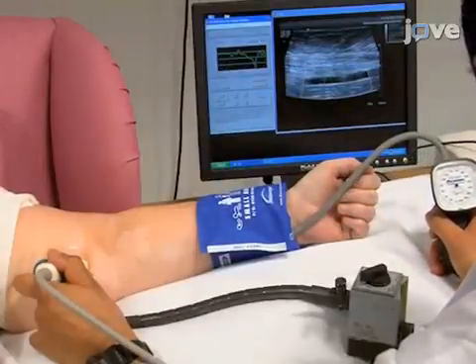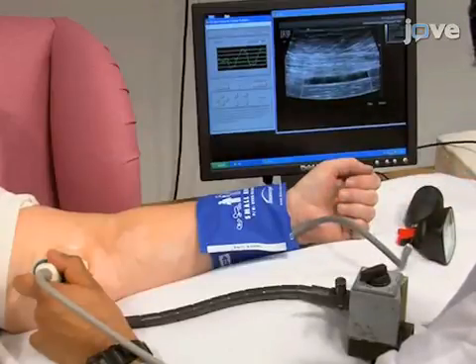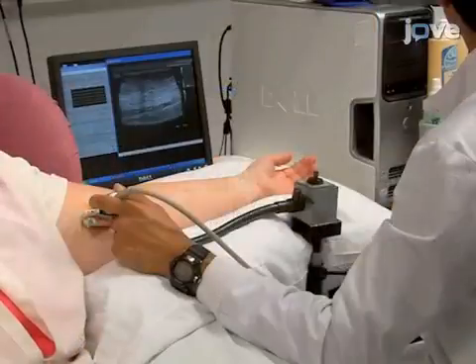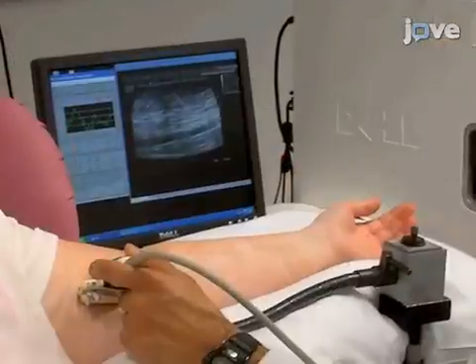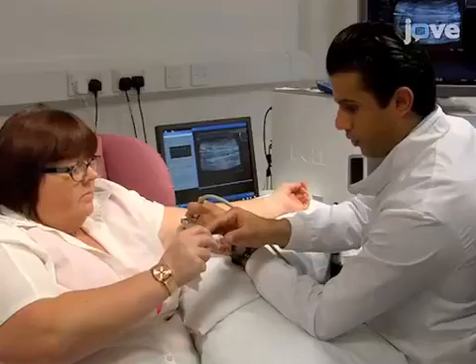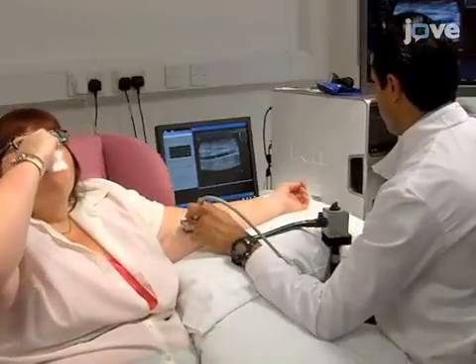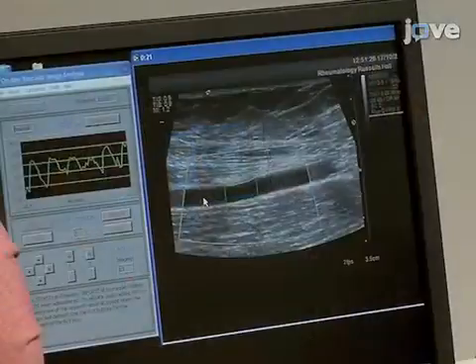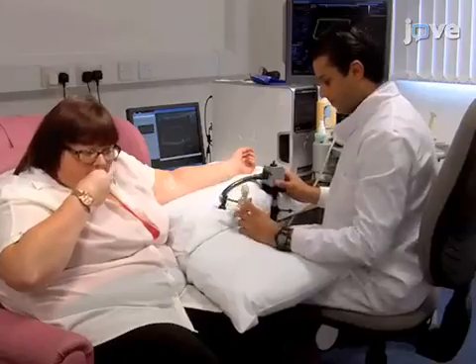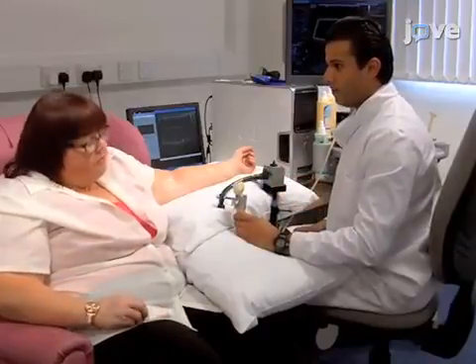At this point, hyperemia is induced which stimulates nitric oxide mediated vasodilation. Then provide a 10-minute rest. Next, relocate the brachial artery and make a new baseline recording of the artery's diameter for 2 minutes. Now ask the participant to sublingually ingest a 500 microgram glyceryl trinitrate tablet and continue recording for 5 minutes. After 5 minutes, the tablet should be removed and the participant should be monitored for adverse effects.